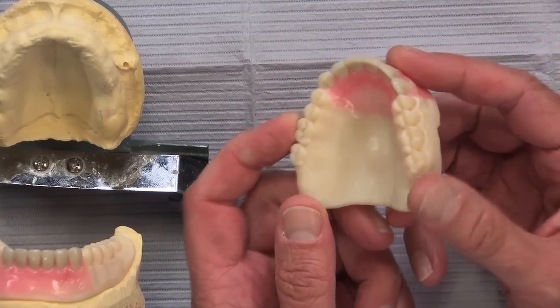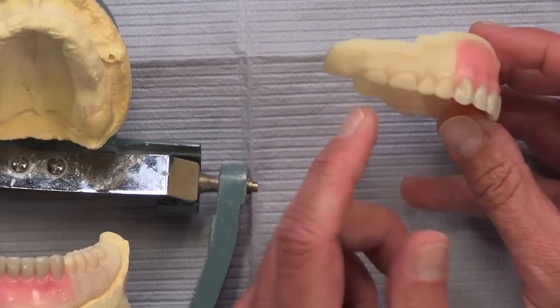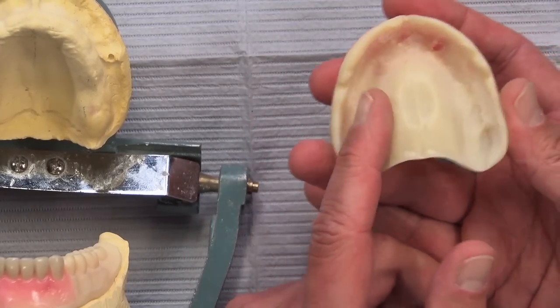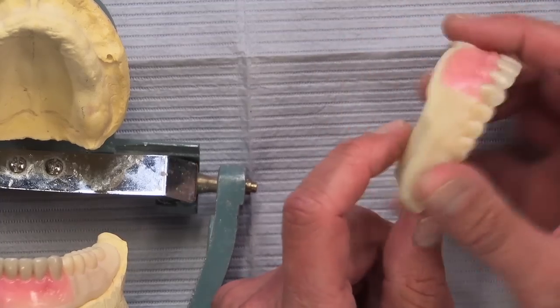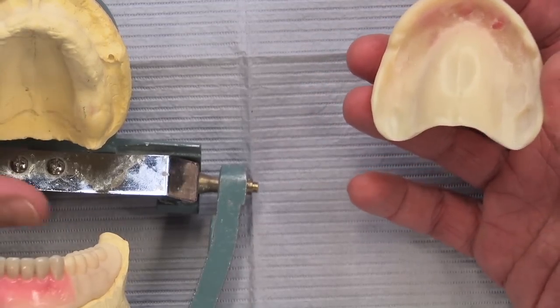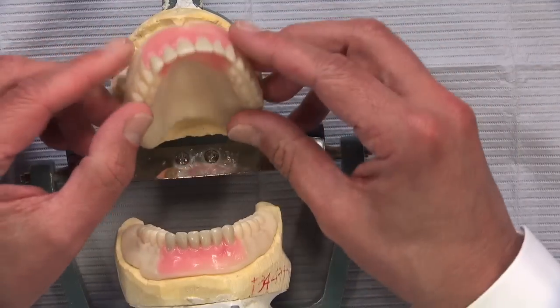You can probably see this is just one shade of resin material that has been printed up here. Unlike the old base plates with wax rims, this is extremely accurate — and you got a feel for that watching me rip it off the model.